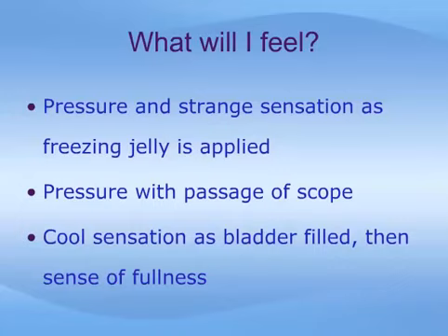You may feel more pressure with passage of the scope and a cool sensation as the bladder is filled, then a sense of fullness or a need to urinate. If done with general anesthesia, of course, you will feel nothing at all.